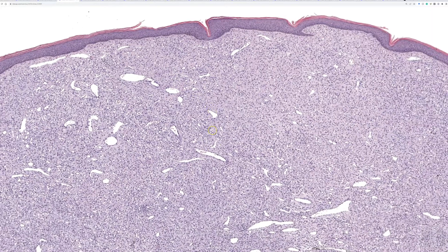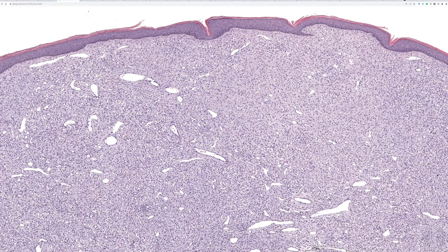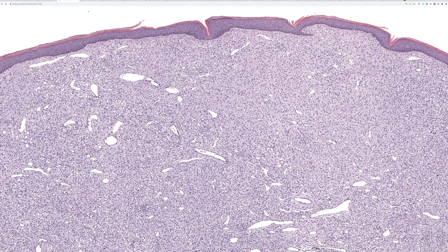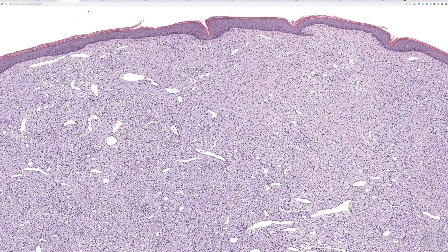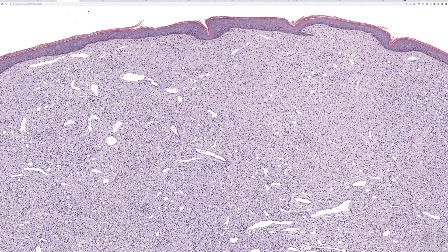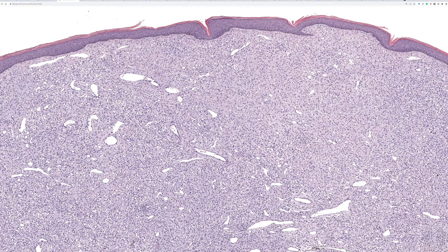I tell you, anytime I see a lesion, whether it's epithelioid, spindled, foamy, granular, xanthomatous, if I see a sheet-like, nodular proliferation of cells filling the superficial dermis, making a dome-shaped papule with a collarette around it, the first thing I think of is epithelioid fibrous histiocytoma.